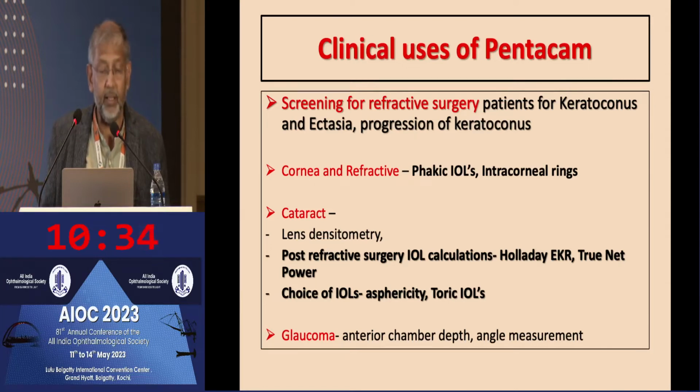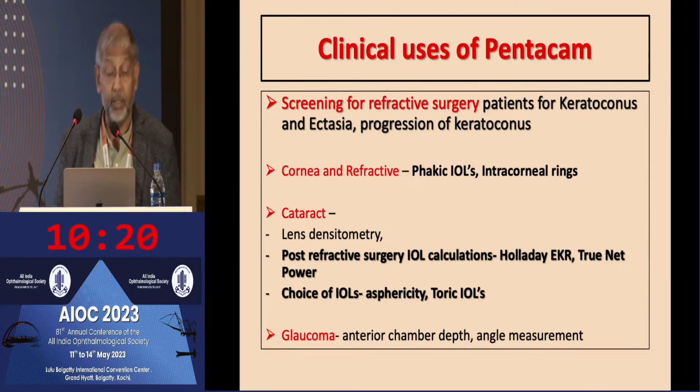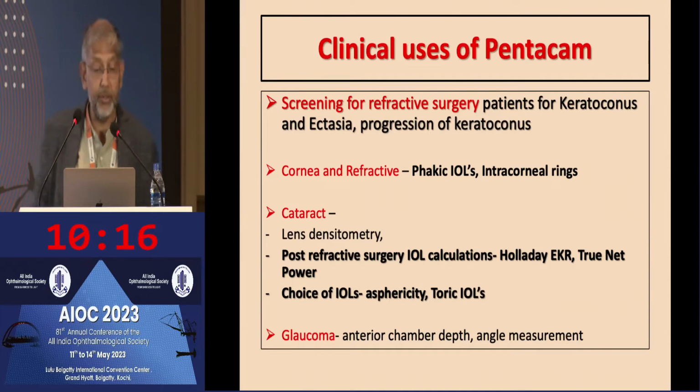Basically, any corneal based refractive surgery or ruling out keratoconus or postoperative ectasia, all those things come in the domain of imaging with Pentacam, and we can have a good idea about the situation, whether the keratoconus is stationary, progressing, or what.